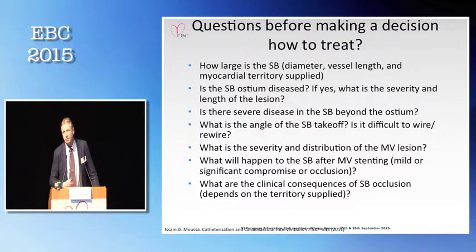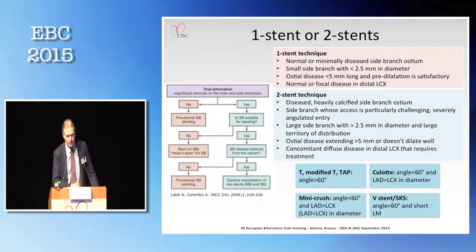Of course, it's maybe not for this particular patient, but if you look at all of our patients, we always need to answer all these questions, like in a checklist, and then we can go for the best possible treatment. This is what we discussed today, and I will not go back again to how to do this, in one or two stents. And for this particular study, as I said, it was only patients where we plan to use this strategy. This is pre-intervention LAD.